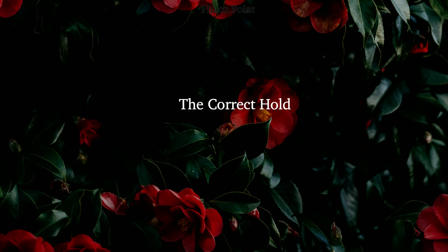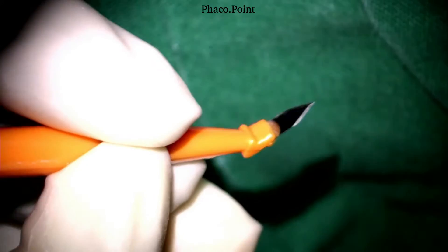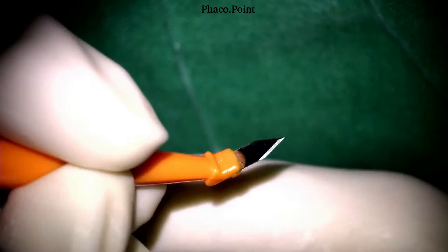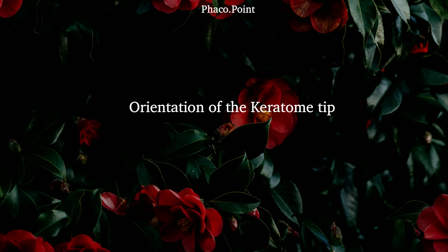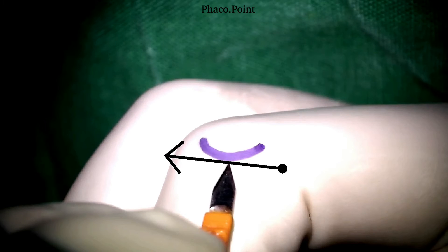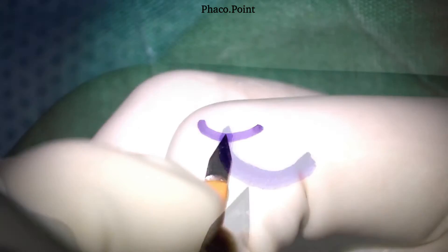We now proceed to understanding the correct manner of holding the keratome. As you can see in the video, you need to hold it like a pen. Next, let's understand the correct orientation of the keratome tip at the limbus — that is, what direction the tip should face before making the incision. If you draw a tangent at the point of entry of the keratome tip, you will notice that the keratome tip is at right angles to this tangent. In other words, irrespective of the clock hour at which you plan to take your incision, it's important to always remain absolutely radial.